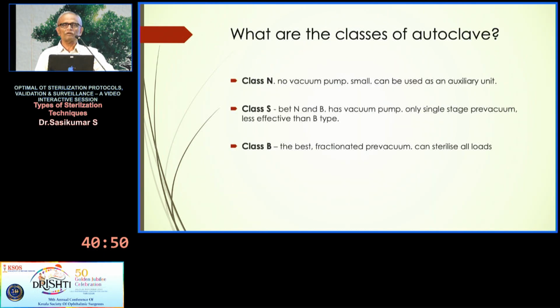Now, what are the classes of autoclaves that we have heard? There are 3 classes of autoclaves.